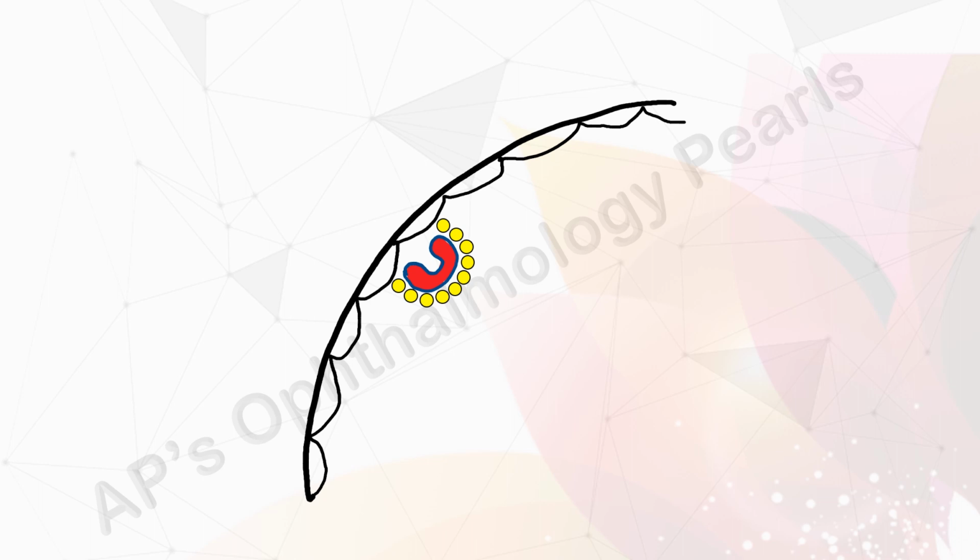Treatment of peripheral horseshoe tear should be extended to the ora serrata if the tear cannot be surrounded using laser. The most common cause of failure in treating horseshoe tears is failure to adequately treat the tear, particularly at the anterior border. Treatment of dialysis must extend over the entire length of the dialysis, reaching the ora serrata beyond each horn or end of the dialysis.